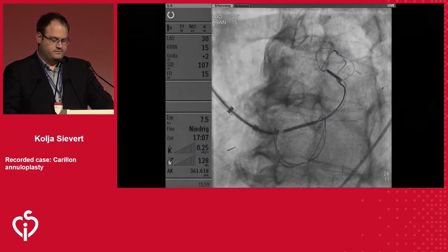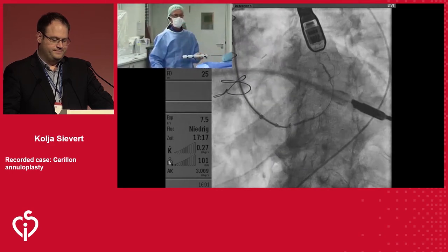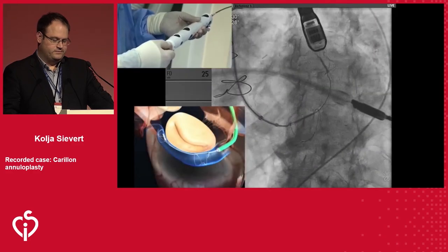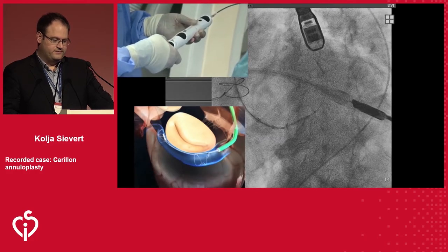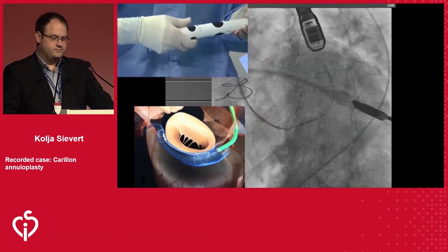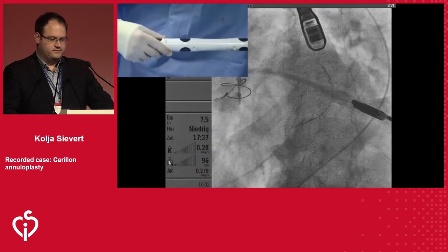Do we need the final angio? Inject. It's barely filling. Yeah, not much to see. Okay, but what we are looking for is basically to make sure that no coronary arteries are obstructed, and that's pretty clear here. So now let me release the red hub here. So now I'm moving to the third knob here, which again has a black arrow, and I'm turning this in the direction of the black arrow, and this will release the device. Okay, and I pull it back immediately.